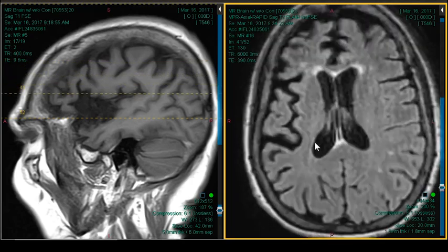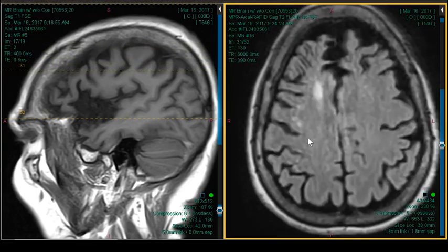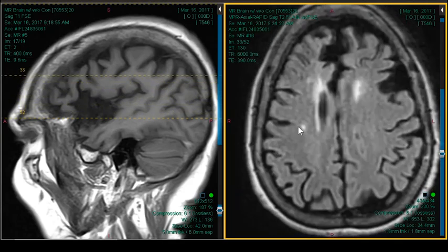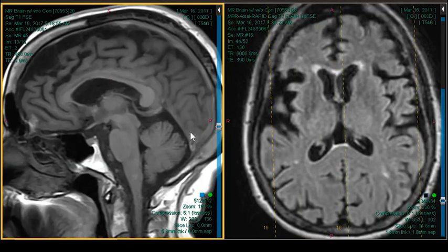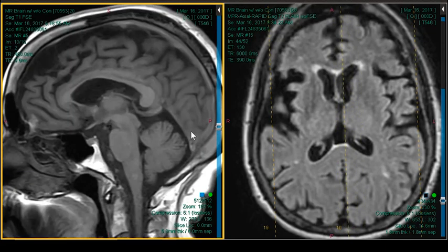Okay, so here we have a case, and there are some abnormalities here. And obviously, there's not going to be a big subdural. Now, with any of these dementia cases, one of the goals is, well, what's the diagnosis and prognosis, but also, is it one of those few instances that's treatable? So one thing I always address in these dementia cases is, is it NPH? That's one thing they're wondering, because that at least is something you can do something about. We're going to talk about NPH later, and when and where, but that's something you also would look at.